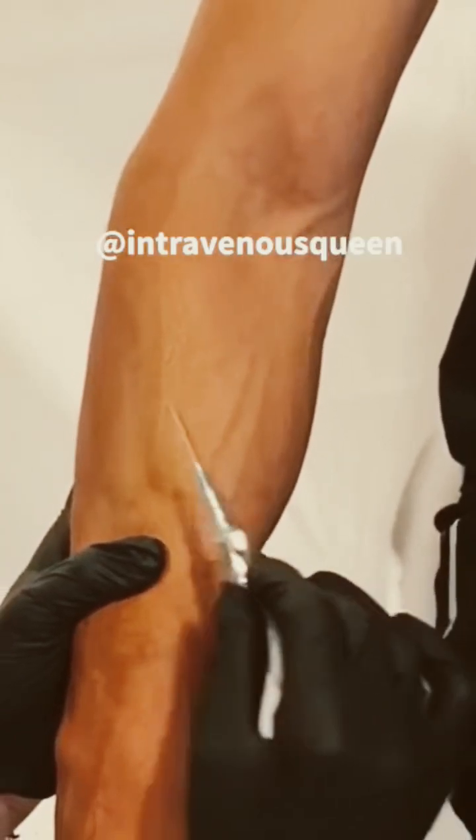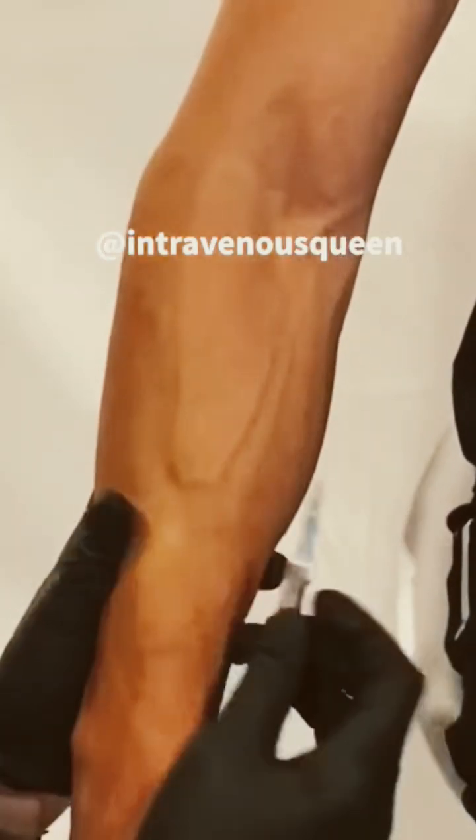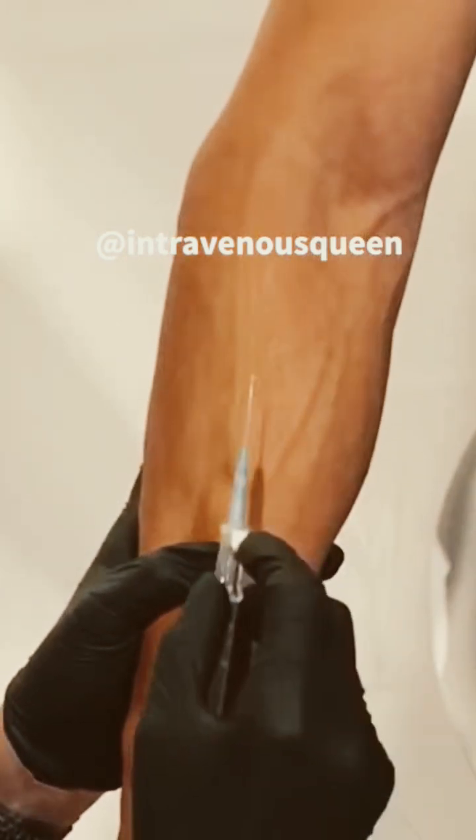The angle of your initial insertion is very important. You want to line yourself up directly in front of the vein.